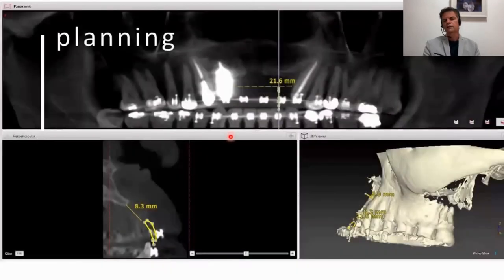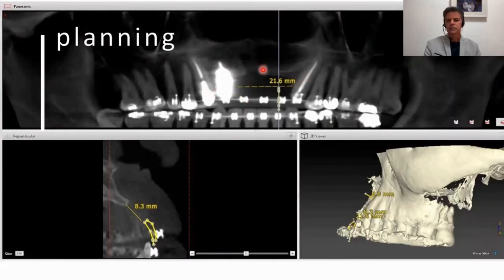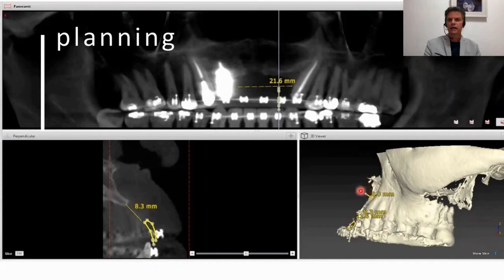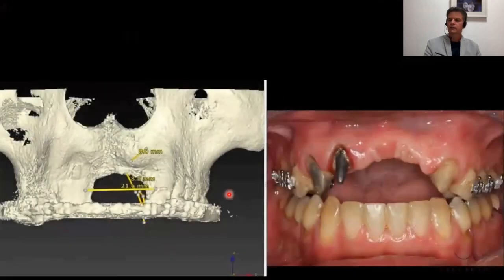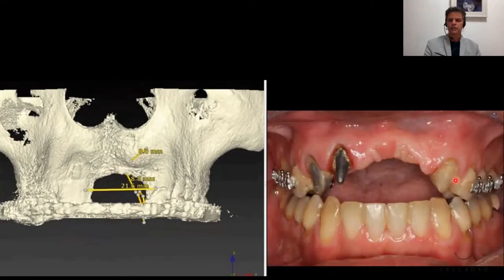Using the DTX Studio software, we can measure the three-dimensional deficiency: 21 mm in length, more than 8 mm in height, and 8 mm in thickness. Comparing the 3D bone view with the clinical view, we can see many vertical defects in this esthetic region.